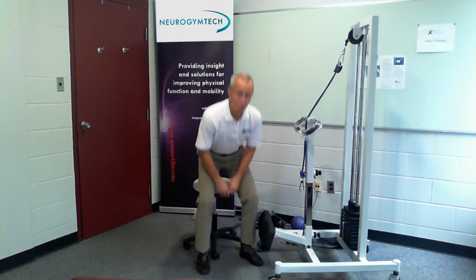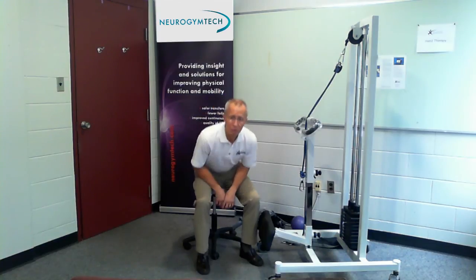We're going to show you today what functional and intense training looks like — because you can go directly to a stand. Imagine if you could take someone who couldn't stand and actually do this over and over and over. First I'm going to run through a demonstration of putting a patient in the machine. Then after that, I'll take it apart to show you the different aspects, adjustments, and a variety of patient issues. Then I'll go through four applications — and stop the video after each one and swap clinician for patient.